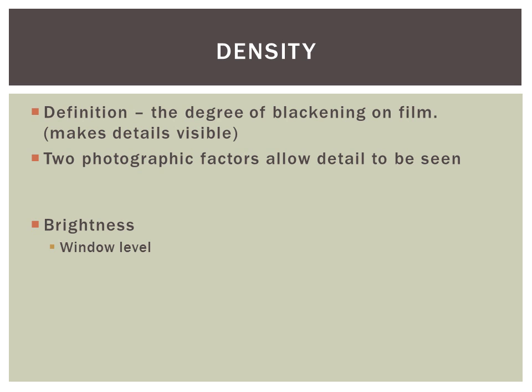Brightness is density as displayed on soft copy for digital, describing light emission. This is done through window leveling, which produces changes in density, and is done post-processing.